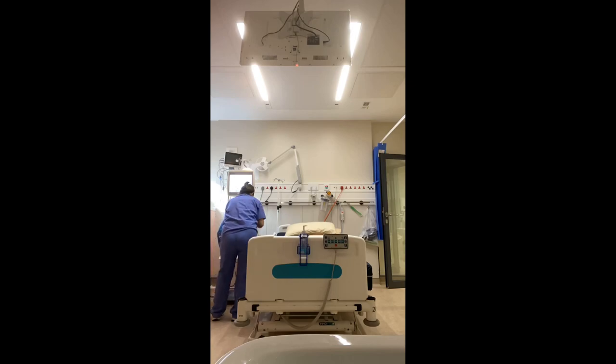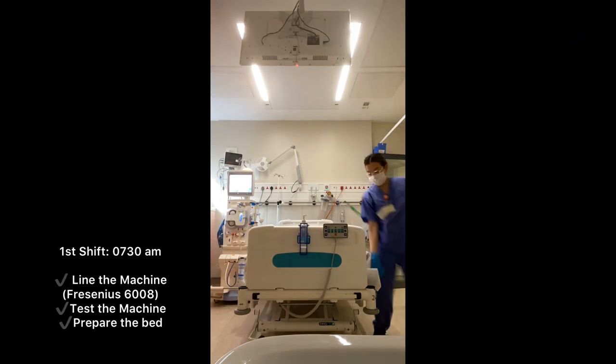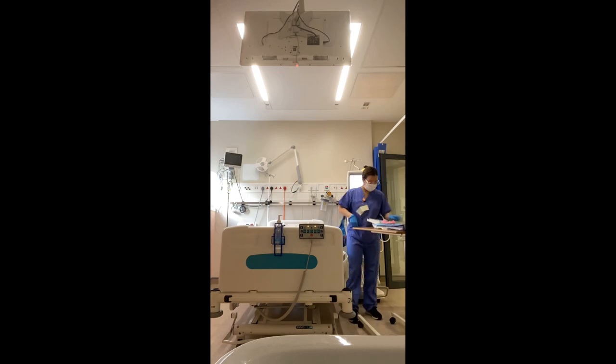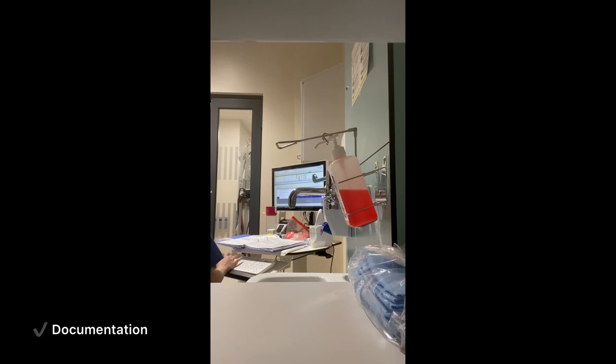Good morning! This is the hemodialysis unit. And for today, we are here in the isolation room. First things first, we prepared the machine for the patient. This is a Fresenius 6008. Then I moved the bed to the other side and I prepared the kit for the patient. This is how it looks when the patient has been hooked to the machine. Then we do our own documentation.